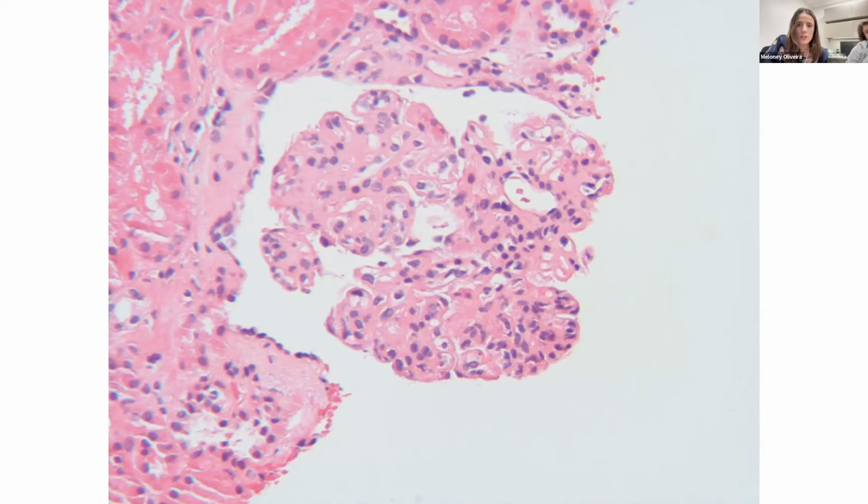Okay. So here we have a high power view of a glomerulus with H&E stain. You can see a lot of mesangial hypercellularity in these areas here. Would you call this endocapillary hypercellularity? Yeah, there's no open loops in that segment. And then there's some mesangial expansion as well. Does the glomerulus have a lobular appearance? It does appear lobular. Otherwise, looking at the surrounding tubules, at least this one up here looks okay. Doesn't appear injured, but not much other architecture. Not a lot of interstitial hypercellularity, and I know he was on the checkpoint inhibitor. No infiltrates in the interstitium here.